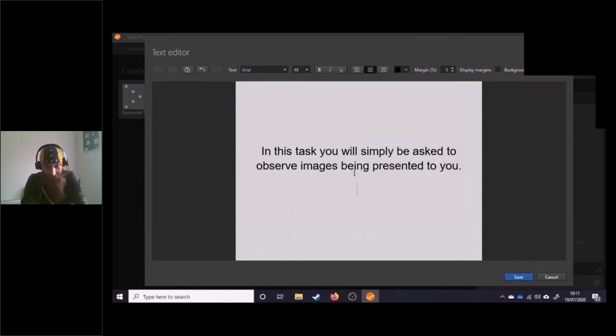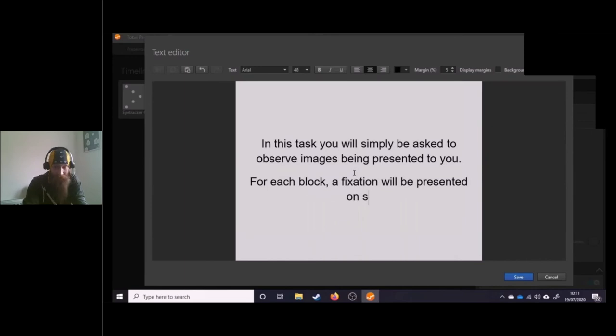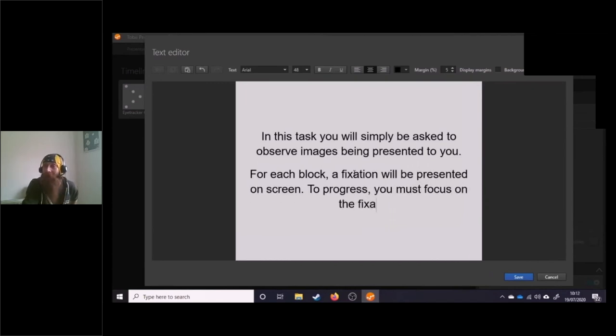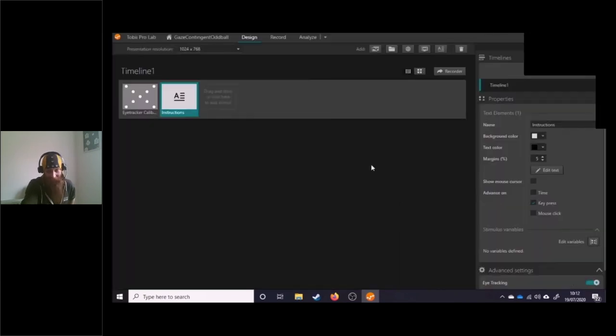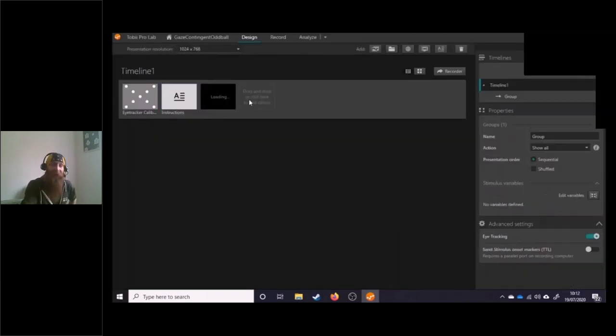The other thing I'll mention at this point is if you are going to be building in Tobii Pro Lab, I recommend setting your screen resolution at the start so that you don't have to come back and start tweaking these things later. I'm actually at the moment on a very non-ideal system, which, given that today we're talking about EEG, and there's therefore an importance for the accuracy and precision of these signals that we're using for time synchronization, I'm not going to say I can rely on the ones I get from this particular setup perfectly.